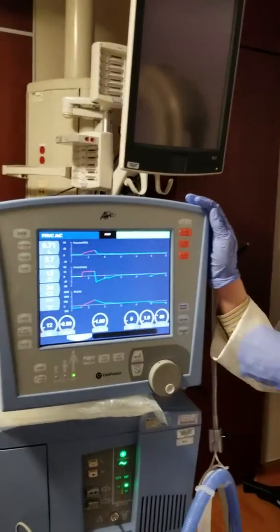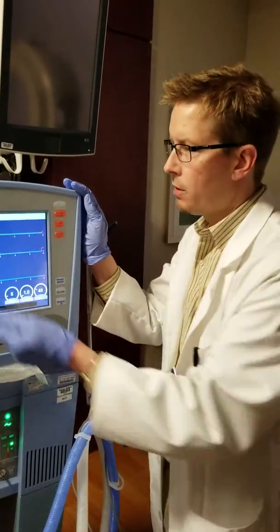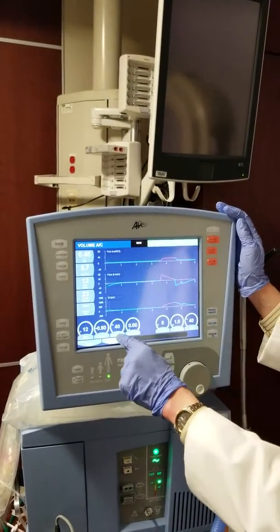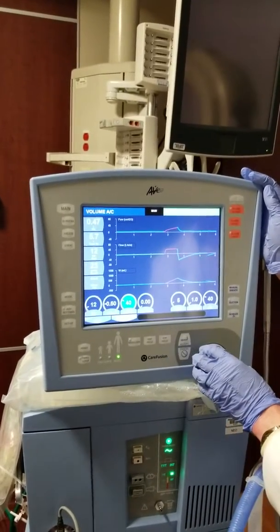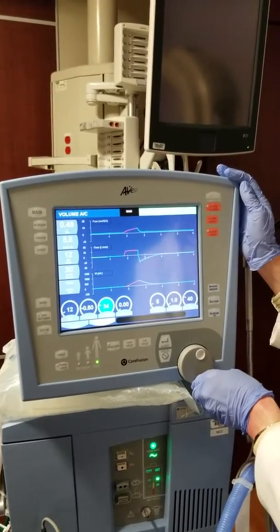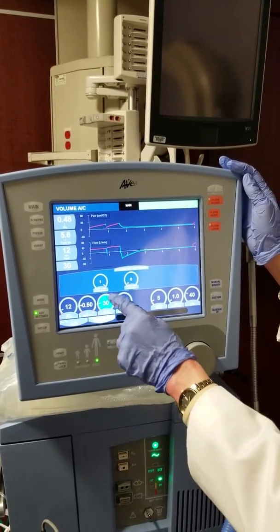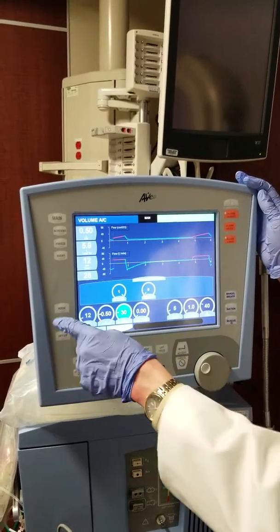Okay, we're in PRVC. You feel that maybe we're over or underutilizing PEEP. Sedate the patient if they are assisting the vent. Go to regular volume assist control. Set your flow rate to equate an inspiratory time of 1 second. Go into advanced settings, go under flow. There's your square waveform. It's already set to square.